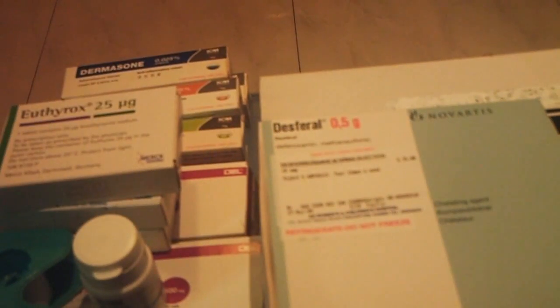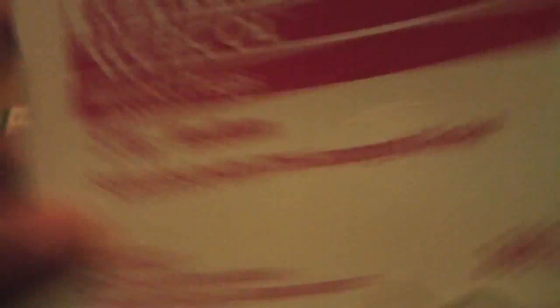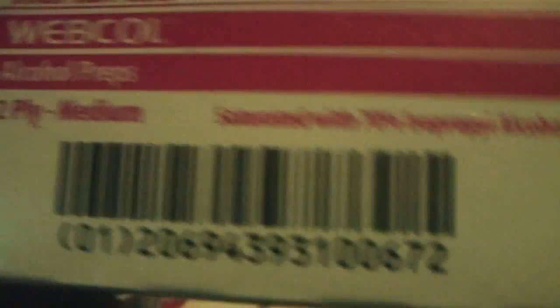Here's the alcohol swabs. They come in 200 pieces — two pieces per slot, so 100 rows. Each row is two pieces. For me, each session I need about four swabs — to clean the bottle itself, the Desferal, after opening the cap, and for aspiration.